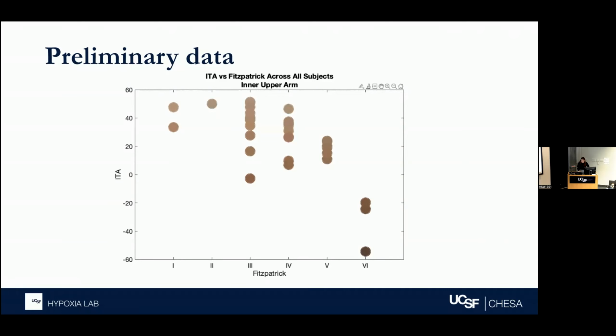So you can see that different operators categorize patients at different Fitzpatricks, and there's a lot of room for subjectivity within this data. And recalling kind of what Greg said earlier, if the FDA requires 2 subjects to have dark skin, first of all, that's up to interpretation if you consider, for example, 5 and 6 dark skin, but then also noticing that there's overlap with 3 through 5. So again, it makes a very big challenge for how we figure out skin pigment. And then the problem gets a little bit more complex when you actually look at these same measurements, but across different parts of the body.